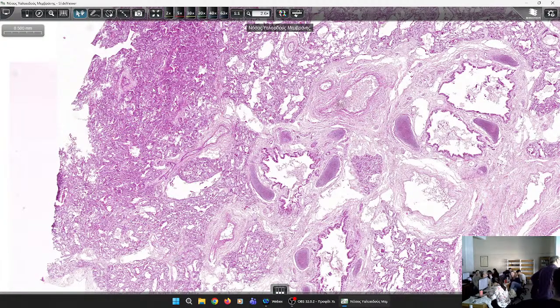An exudate is common in pneumonia. So basically that fluid is the surfactant that is lost. In the case of the newborn, yes. But in the case of the adults, there are tissue remnants appearing like hyaline membranes instead of pneumonocytes, because this is damage and you cannot have the gas exchange because pneumonocytes are no longer functioning. They are displaced by the hyaline membranes.